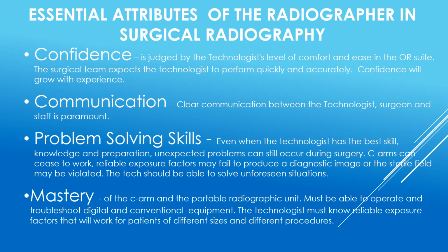Essential attributes of the radiographer in surgical radiography: confidence, communication, problem-solving skills, and mastery. Confidence is judged by the technologist's level of comfort and ease in the OR suite. The surgical team expects this technologist to perform quickly and accurately. Confidence will grow with experience. Communication. Clear communication between the technologist, surgeon, and the staff is paramount.